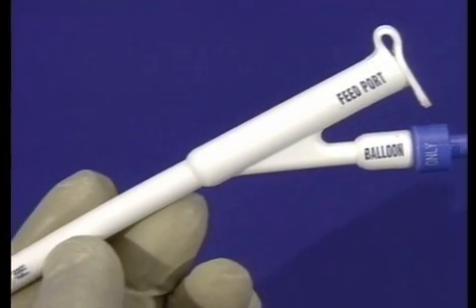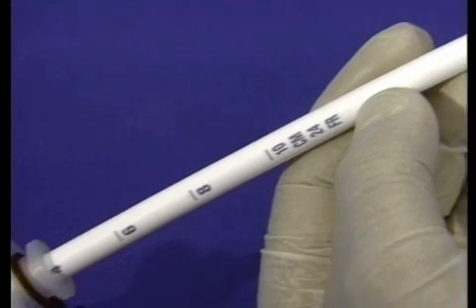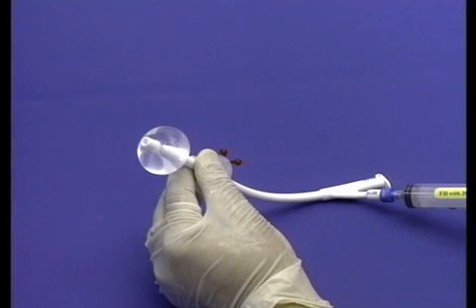The PEG24-BRT is clearly marked with centimeter increments and a radio-opaque tip to permit monitoring for potential migration. The PEG24 replacement balloon is made of medical grade silicone and designed to provide a secure seal against the interior stomach wall.